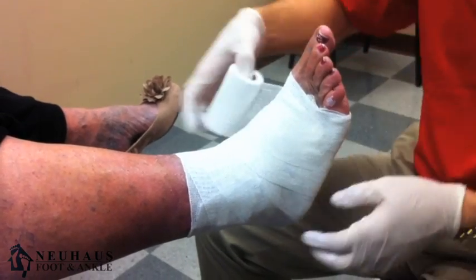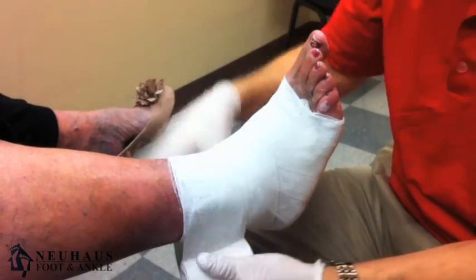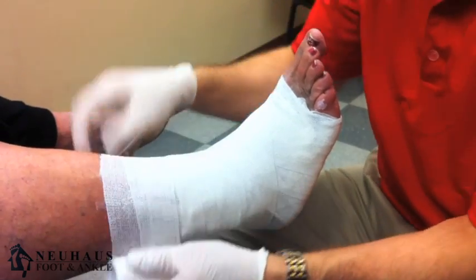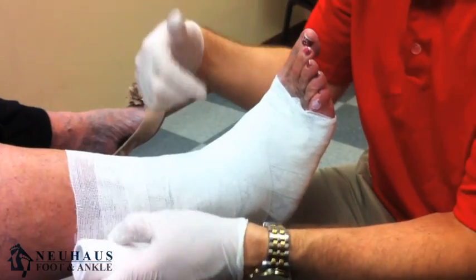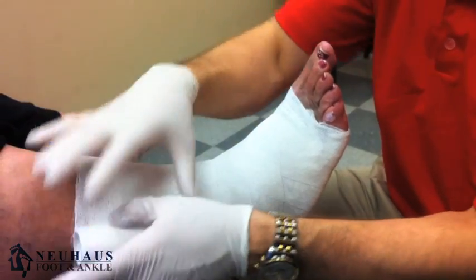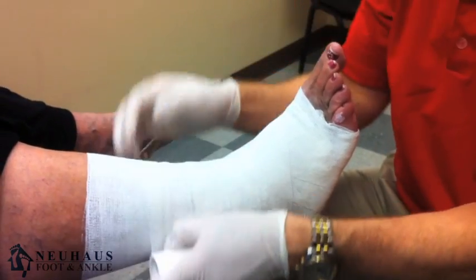Most people will wear this for anywhere from three to five days depending on the severity of the problem. In this case, because this wound is very large, it needs to be changed every two or three days.